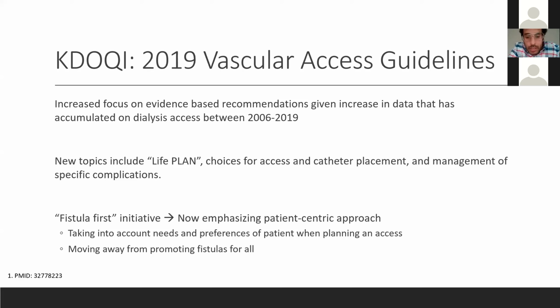But I'm going to go over a very brief cursory review of some of the major position changes or statements that were made. So if you read through this, what you come away with is that this working group really recognized that between 2006 and 2019, there was a lot of literature and data that's been published in that time period.